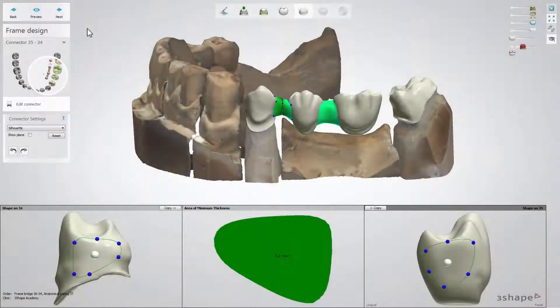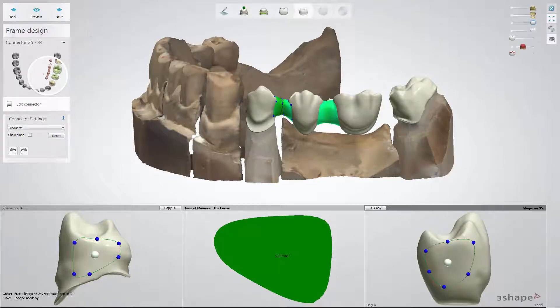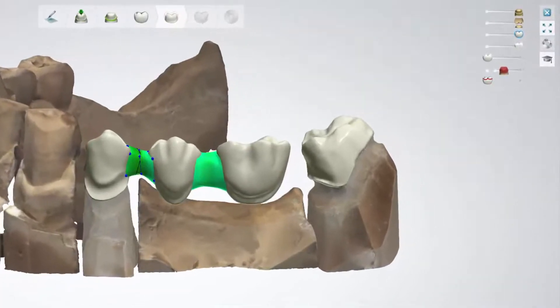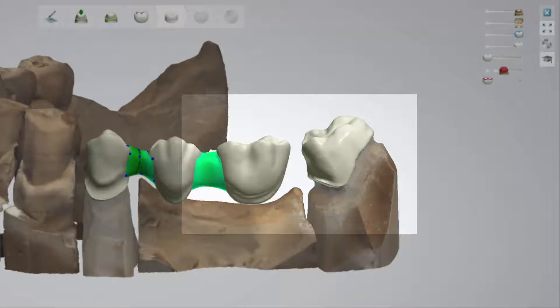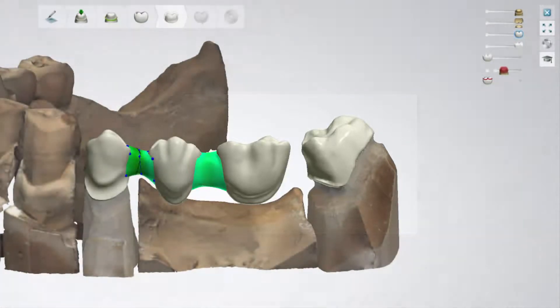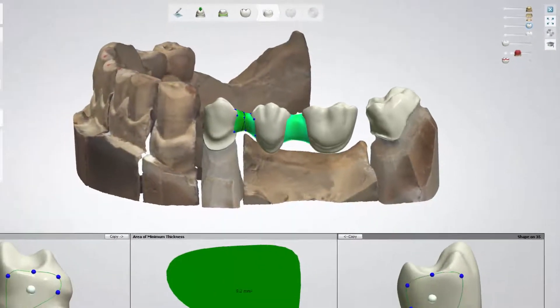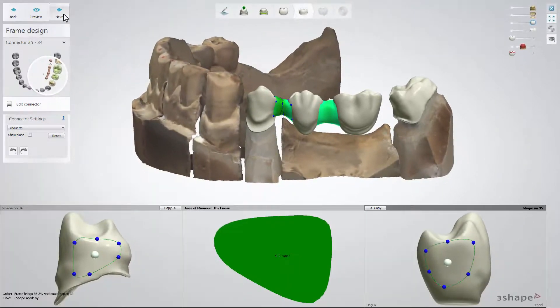On the frame design step, you can see the difference between a one-piece bridge and the split one, which is the absence of one connector. This is actually the area which is going to be designed at the next step.